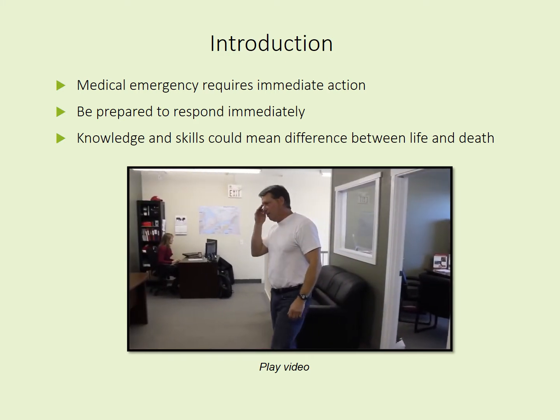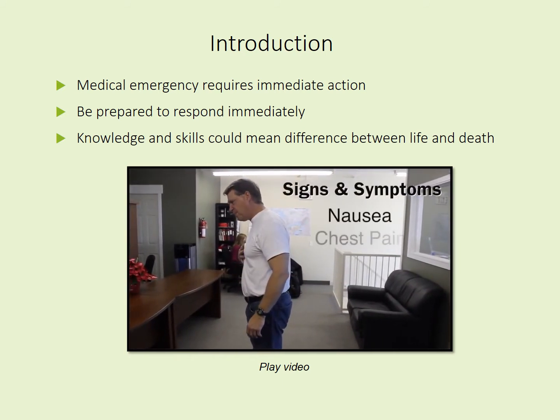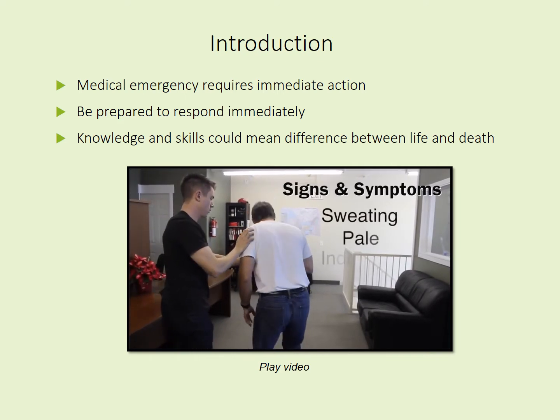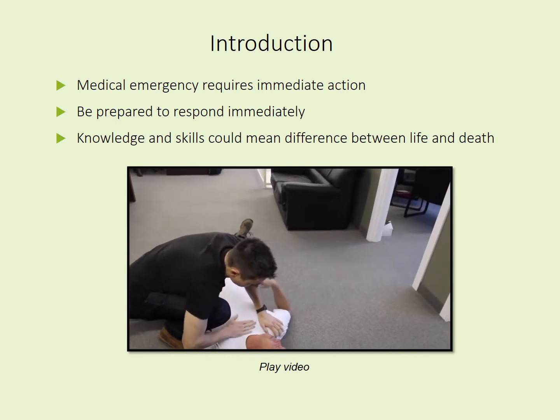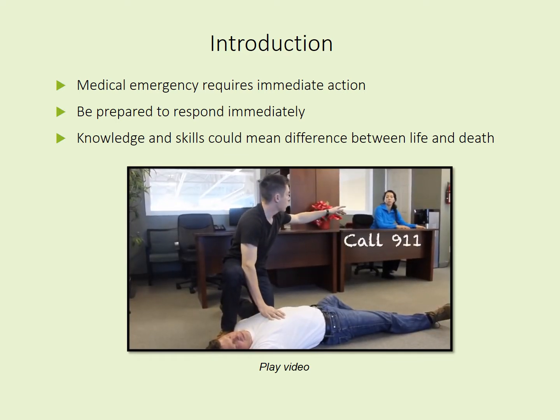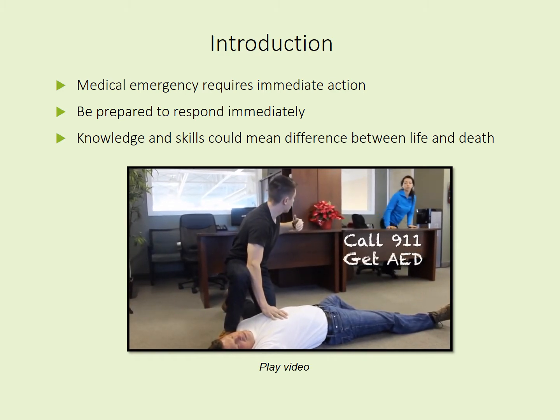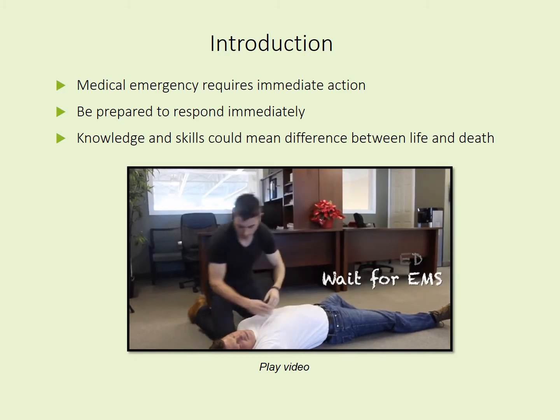Ian, I think I need some help. I'm not feeling very well. What's wrong, Roger? I just feel a little nauseous. Got some pressure in my chest. Okay, let me just take a seat here. Roger! Oh. Roger, wake up! Roger! Jane, go call 911. Tell them we have someone who's unconscious. Barb, go get the AED. Bring it back to me as soon as you can. Kelsey, go stand outside and wait for the paramedics.